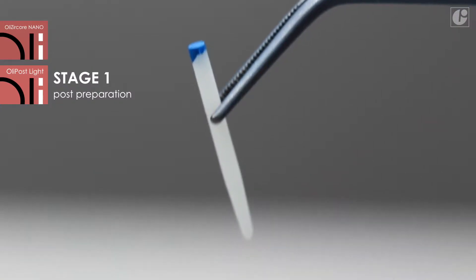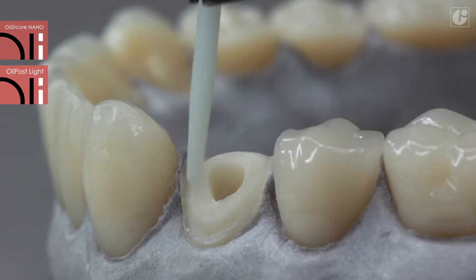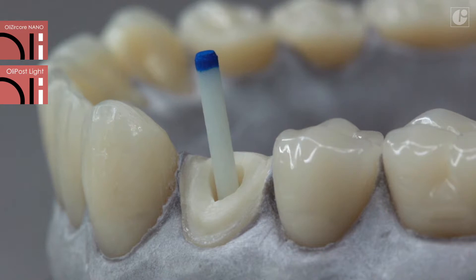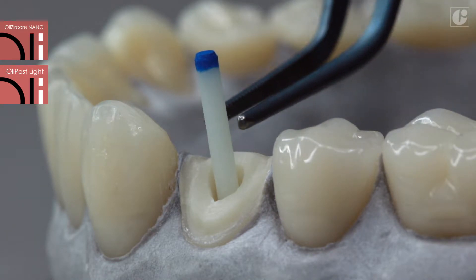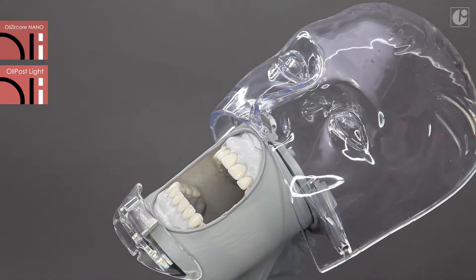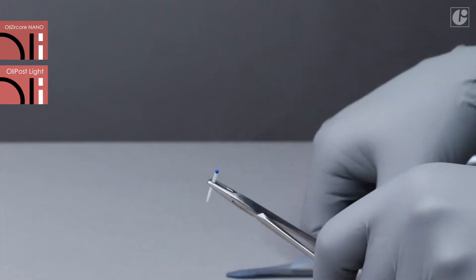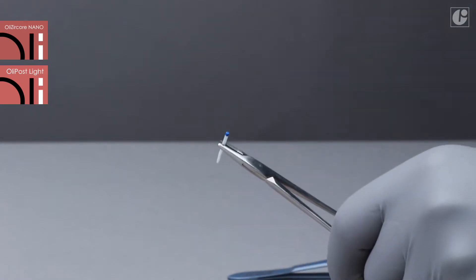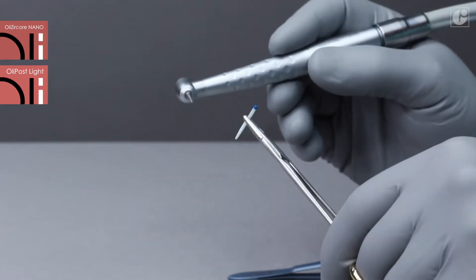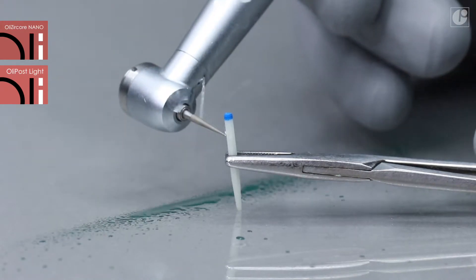Before canal etching, a suitable post diameter needs to be chosen and its length should be adapted to the prepared space. The optimal proportion is two thirds in the radicular part and one third in the coronal part. The post should be shortened to the desired length.